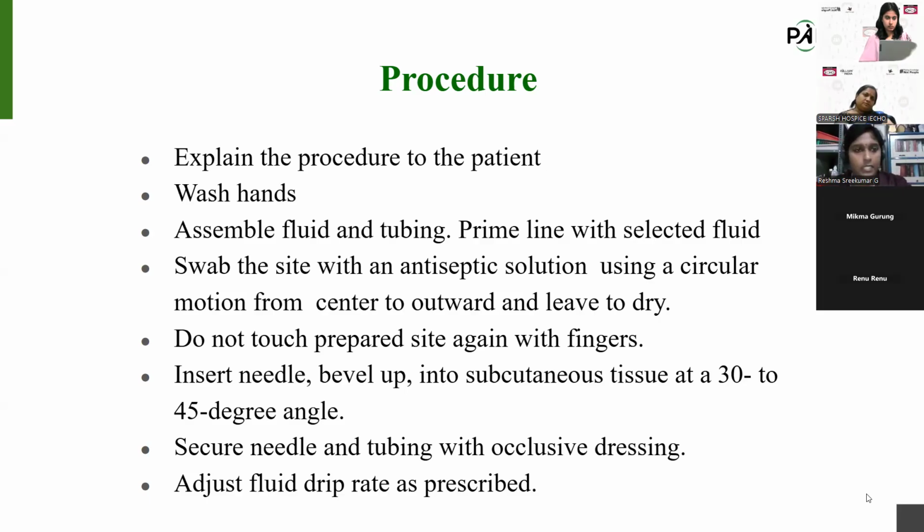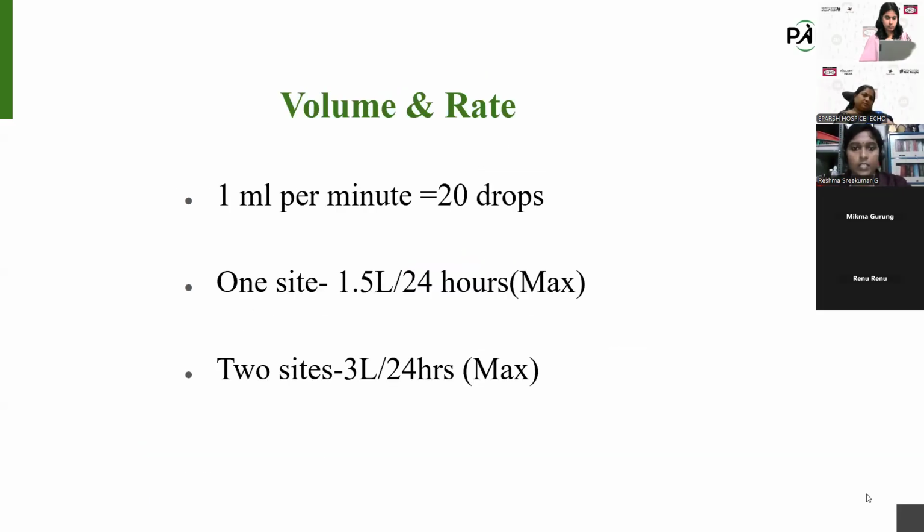Adjust the fluid drip as prescribed. Next, we are discussing about the volume and rate. And the main point you should remember is we can give 1 ml per minute. Maximum we can give 20 drops per minute.